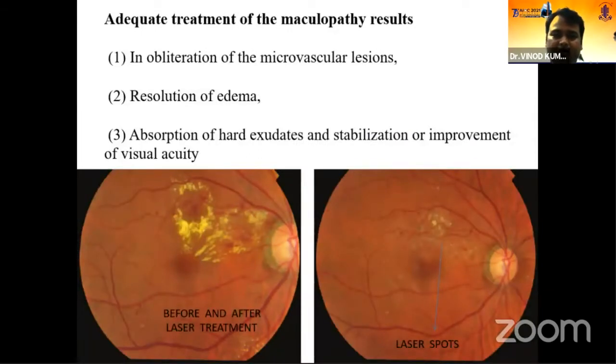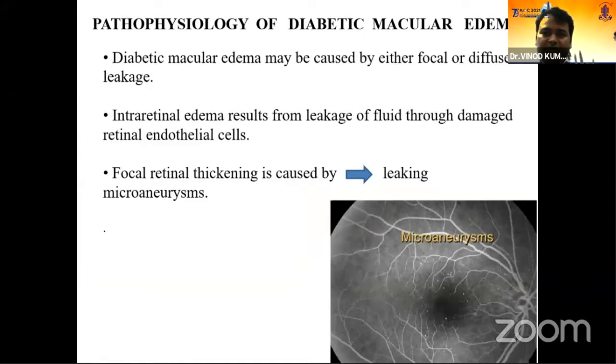How do we know that the focal laser treatment has worked? After 3 to 4 months of the laser, you will see obliteration of the microvascular lesions, reduction in macular edema, absorption of hard exudates, and stabilization and improvement in vision. If you have followed the correct protocol and settings, you will get such pictures — before laser there are a lot of hard exudates in the macular area, and after 3 to 4 months there is significant decrease in hard exudates and the red dots between them.